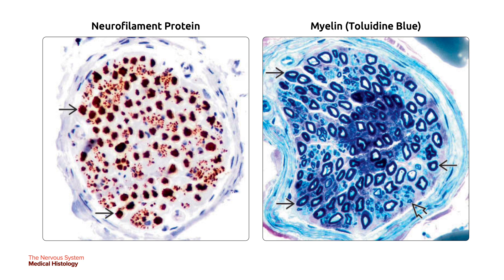On the left is an immunohistochemical stain for neurofilament protein showing large myelinated axons in a single black arrow that are strongly positive. The variable diameters of the staining axons reflect the different amounts of myelin surrounding each nerve fiber or axon. Unmyelinated axons are very narrow and difficult to detect. On the right, myelin stains dark blue in this toluidine blue-stained plastic section — a mixture of large and small diameter myelinated nerve fibers can be seen here.